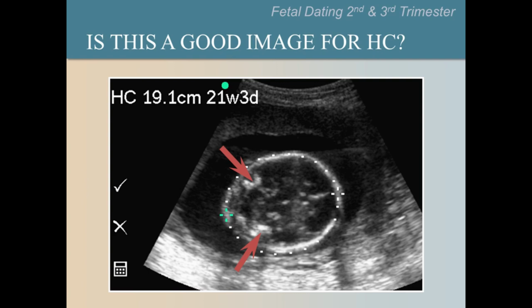There should be no bright white structures in this area. You shouldn't see any bone. This is even lower than the cerebellum.